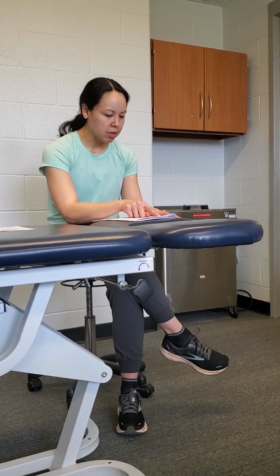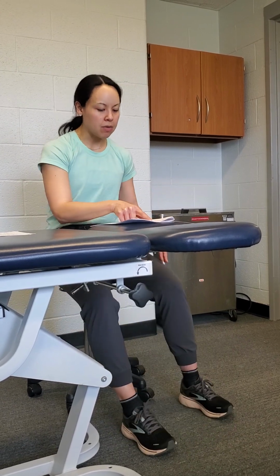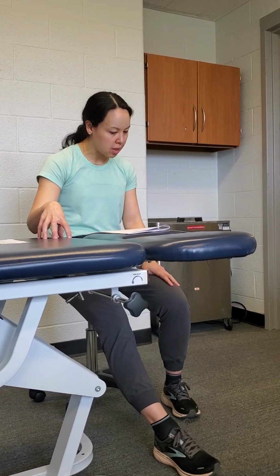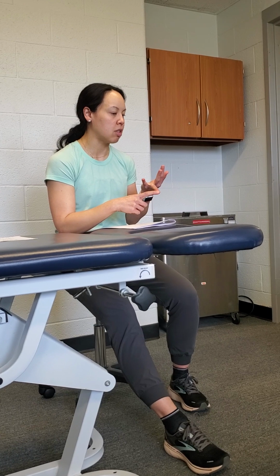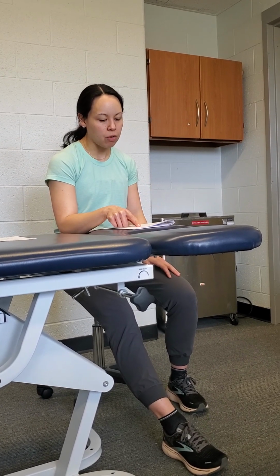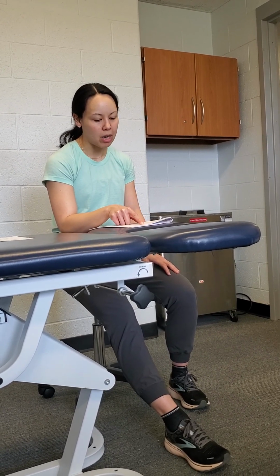For example, investigators applied the neuromuscular e-stim at both 60 to 90 degrees of knee flexion without BFR, then applied BFR with the stim, and that actually increased the stimulation to 10 to 30% of muscle contraction. So just a much better quad setting occurring. And if you talk about the pain modulation and the swelling, it just makes sense to combine them. It also resulted in a 4% increase in muscle thickness and a 7% increase in Biodex muscle contraction.